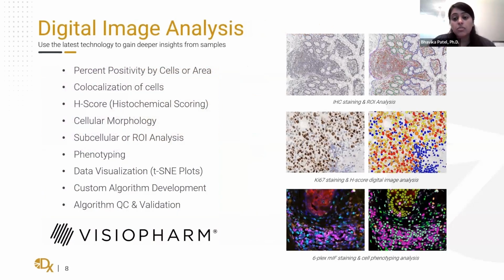Multiplexing can provide a user many data endpoints if analyzed using a powerful system. In our lab, we use the Visiopharm platform, which integrates deep learning to image analysis.